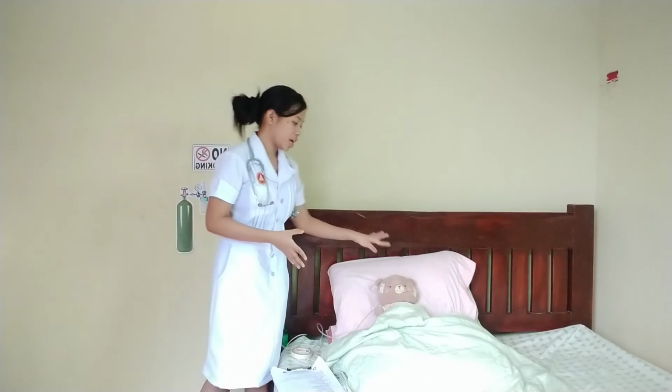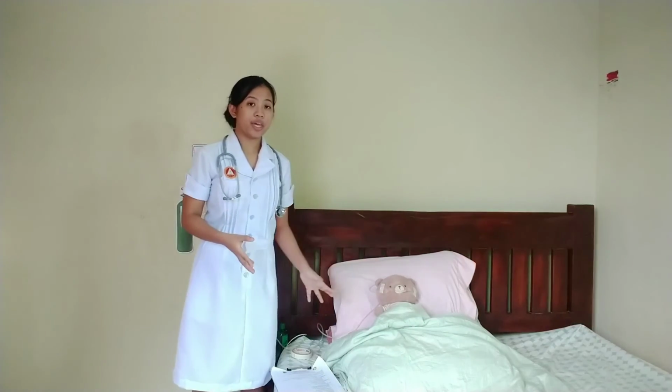We should also check behind the ears for any irritation or discomfort that may be caused by the tubing, and if it is present, we can pad it with gauze to relieve discomfort.